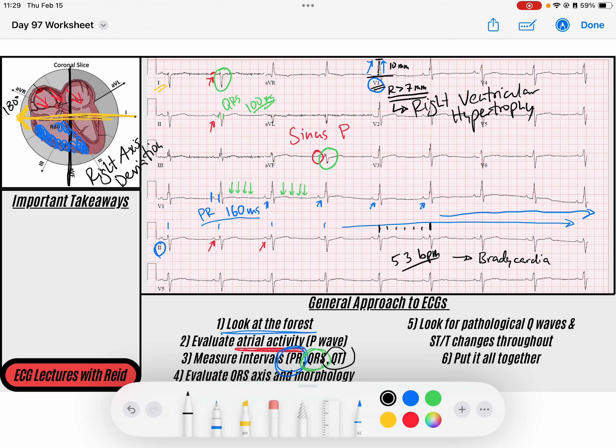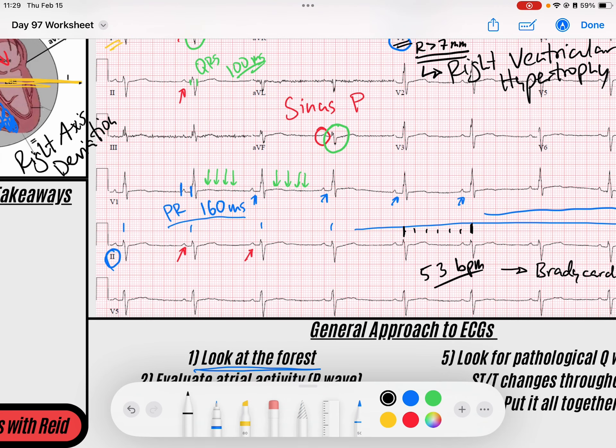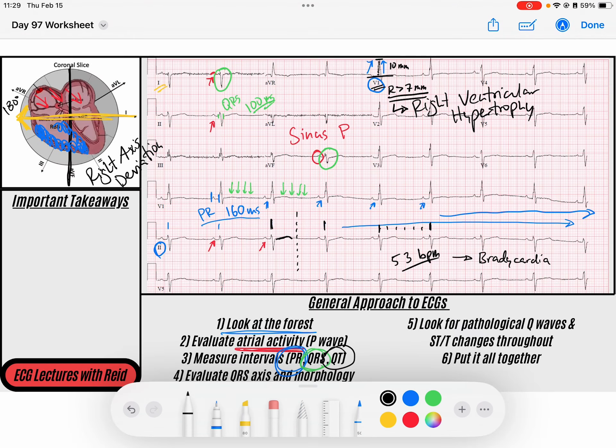Now let's look at our QT interval. My QT seems to be pretty normal here. If I take my R to R interval right down the middle, my T wave should be finished by then, and you see that that does appear to be the case. So I have a normal QT interval. And then I'm going to scan for pathological Q waves and ST or T wave changes throughout. I don't see any Q waves. You're going to see some repolarization abnormalities due to the ventricular hypertrophy, but nothing that is elevated or depressed that makes me concerned for any ischemic changes in any anatomical distribution.